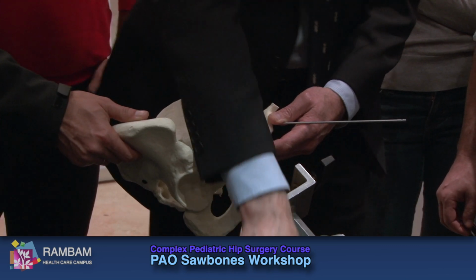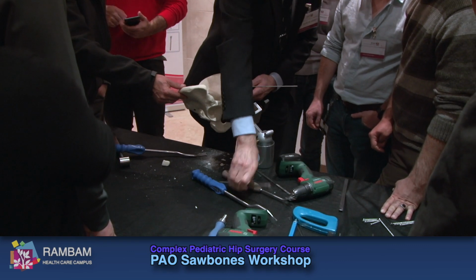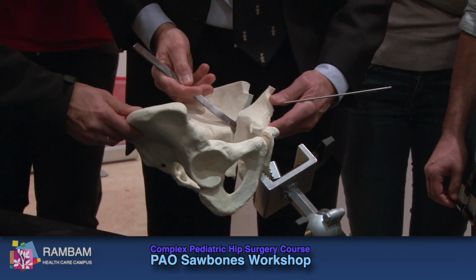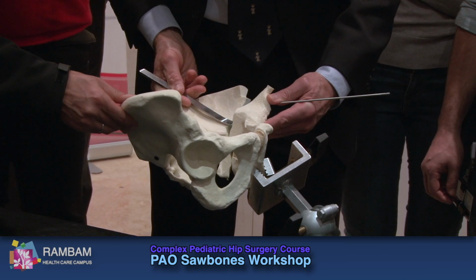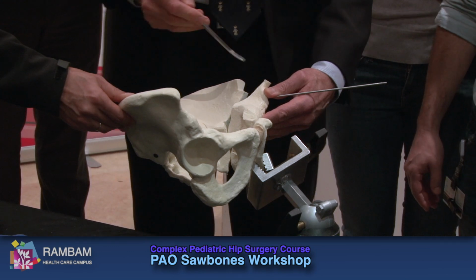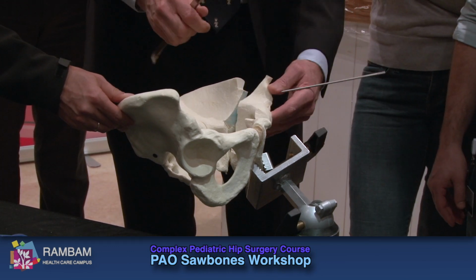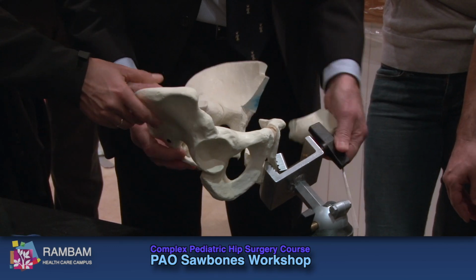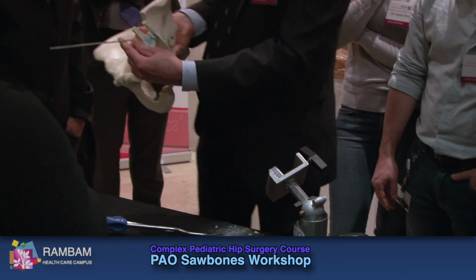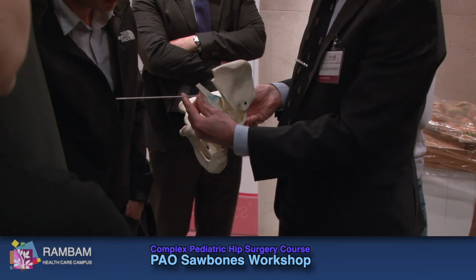Okay. The other thing you can do is you can take an osteotome here like this, and I do down here. So I should have on the outside. I should have the outside of the bone here. In that position, I should have the outside.